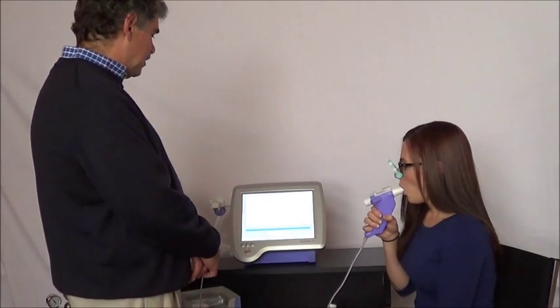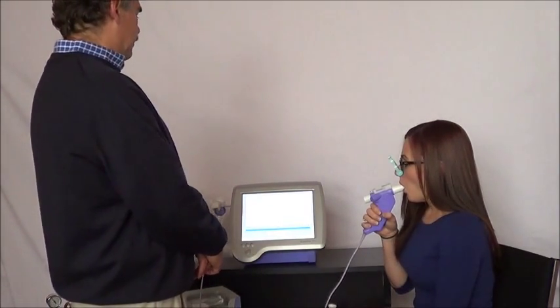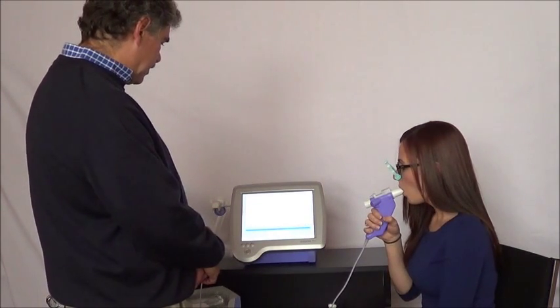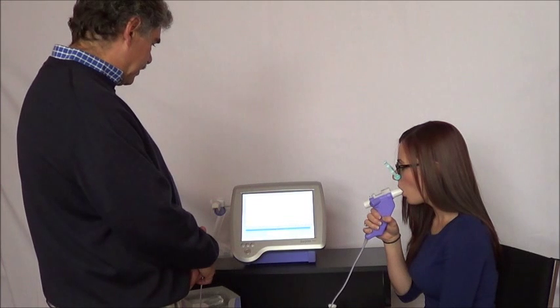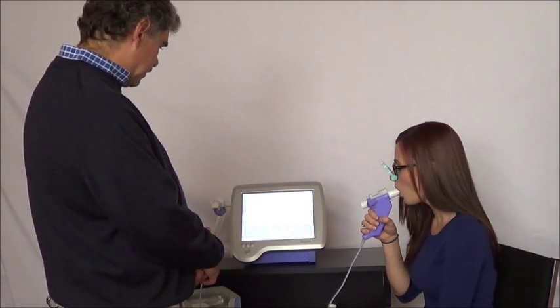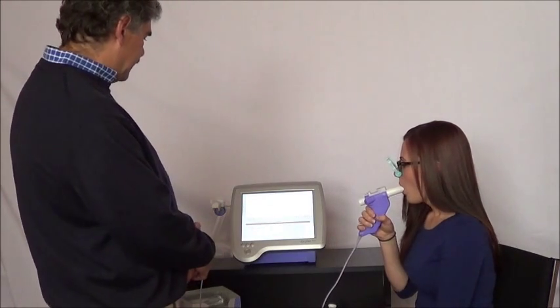Whenever you're ready now, go ahead and take a big inhale — fill it up. Now a relaxed exhale, exhale, keep going, keep going. Good. Excellent.